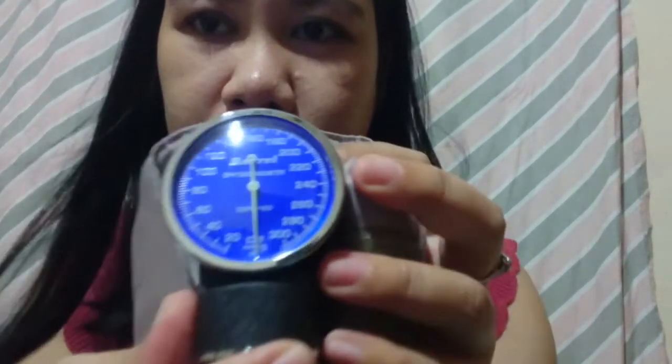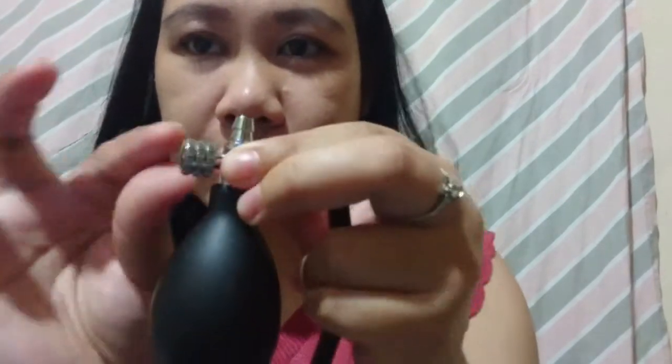Now let's proceed with the other parts. This is the inflation cuff. Here is the rubber bladder. And this is the aneroid gauge. Let's go and connect this — this is the bulb and this is the valve.